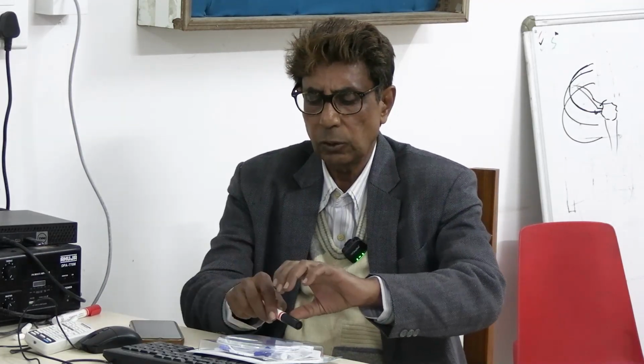Corkscrew movement. Again and again corkscrew movement. Introduce, again withdraw, again introduce. But the guide wire should be in place. You should not lose the guide wire, and the end of the guide wire should be outside. Otherwise, if the whole guide wire is introduced, then you have to go for surgical removal of the guide wire.